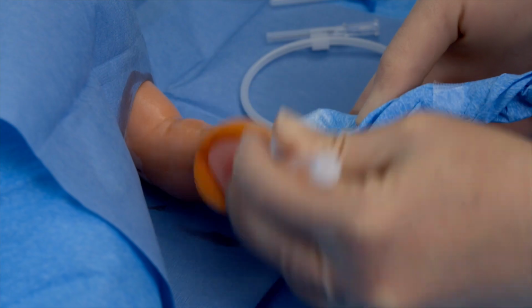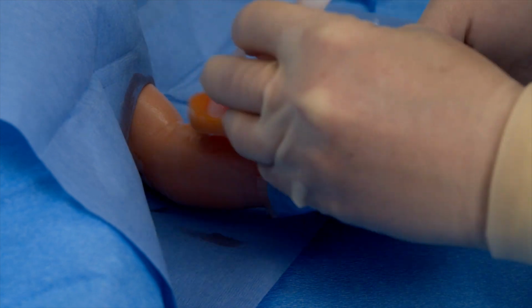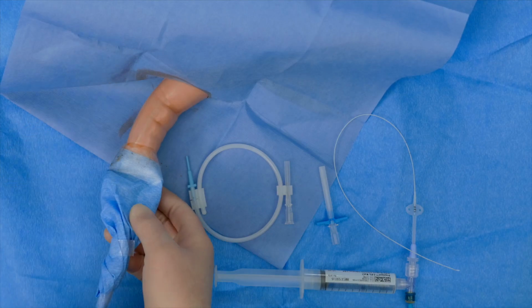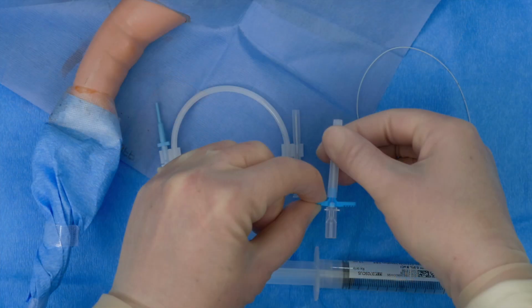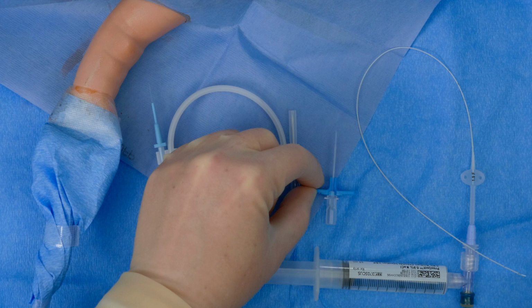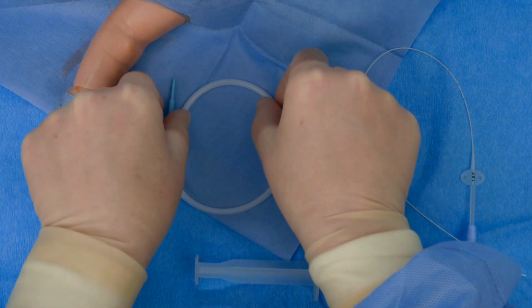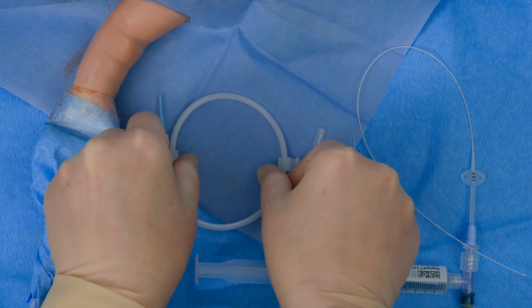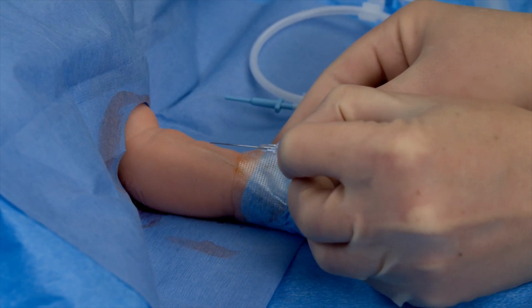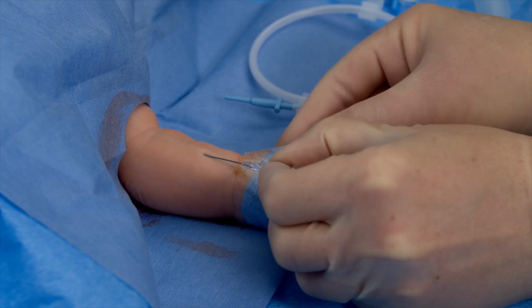Once the infant has been appropriately prepped and a maximal sterile barrier and sterile working field have been set up, open the peelable pouch and drop the MST components on your sterile field. Next, remove the covers from the sheath dilator assembly and the introducer needle and pull the atraumatic tipped guide wire from its holder 2 to 3 centimeters. Once the equipment is ready, perform the venipuncture at the previously selected site.